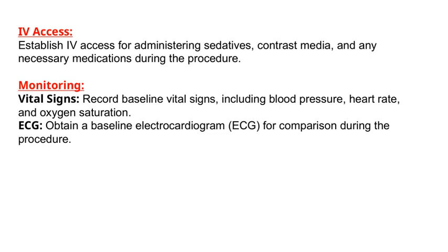Having this baseline is important because it allows us to compare and identify any new changes during the procedure, which can be vital for patient safety. Overall, establishing IV access and thorough monitoring are foundational steps to ensure a safe and effective procedure. They help us stay in control and respond quickly to any issues that might arise.